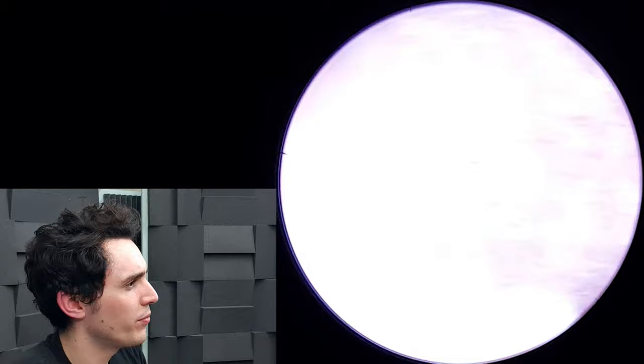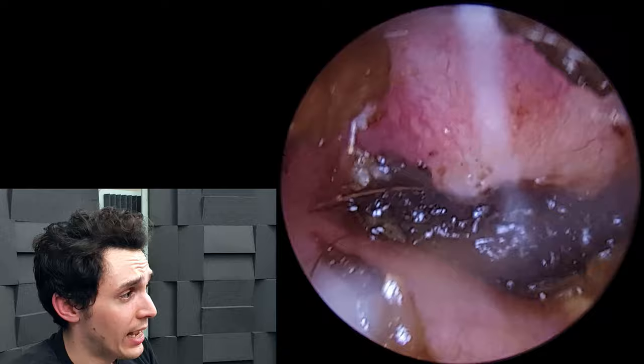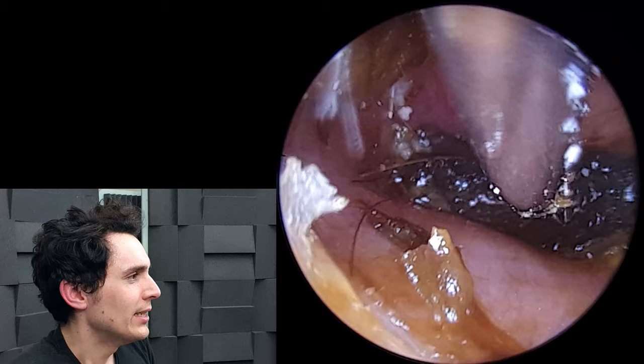We're going to remove a little bit more just to give us a clear path in there. As always I'll lay it all out on the tissue so you can see the amount we've removed, and I'll give you a shot of the tank as well — that's always useful to see what's been removed.